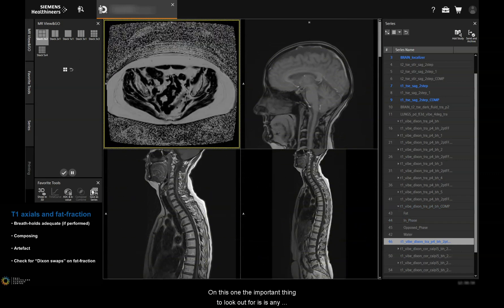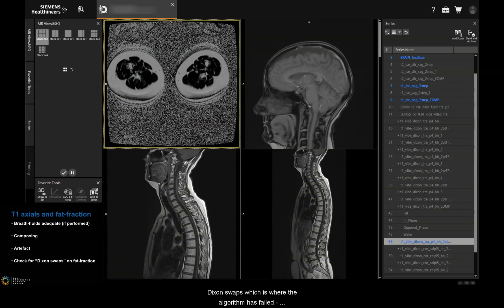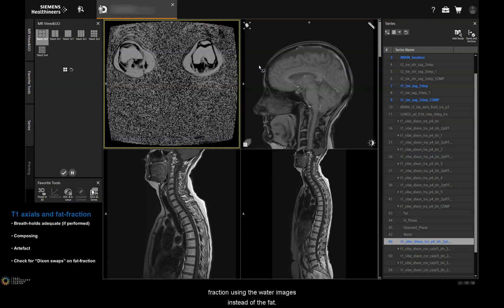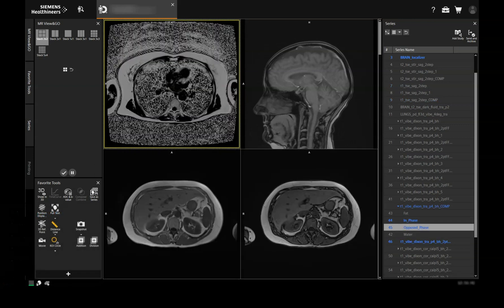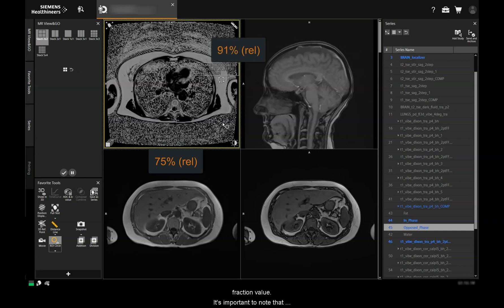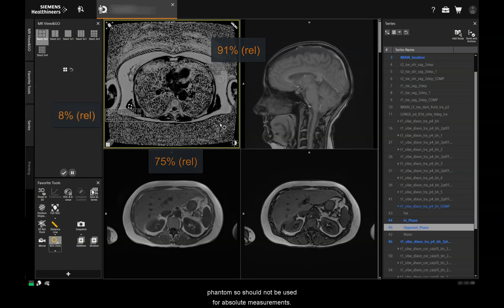The important thing to look out for on the fat fraction is any Dixon swaps, where the algorithm has failed — you'll notice that if the fat goes black. To counter this, you might need to perform a manual reconstruction of the fat fraction using the water images instead of the fat. By drawing circular regions of interest, you can read the mean values, and when divided by 10, they'll give you an approximate and relative fat fraction value. It's important to note that these fat fractions aren't calibrated by phantom, so should not be used for absolute measurements.